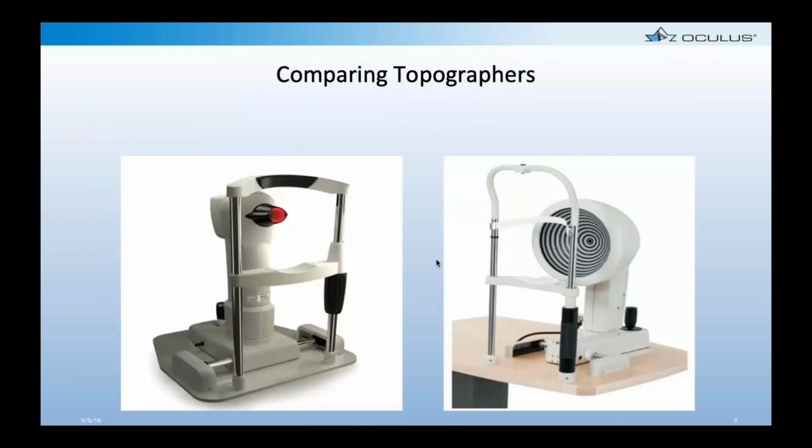So when you look at corneal topographers, and I'm excluding the corneal tomographers from this discussion, we're just talking about corneal topographers. These are Placido disc instruments where we're getting light reflecting rings off the cornea, and the instrument picks that reflection of rings back up, and then it takes that data and does calculations to tell us things about the corneal shape and elevation. Some of it is real measurements and some of it is interpreted and calculated measurements. We're talking about a tear layer dependent test. It's got to have a good tear layer. But it's telling us a lot about the surface of that eye.